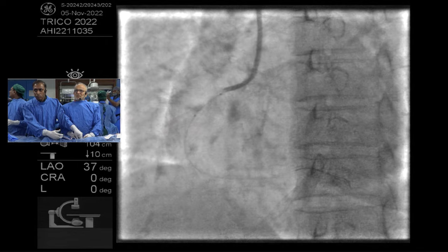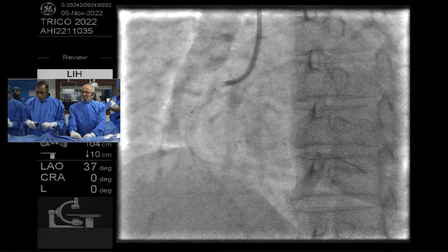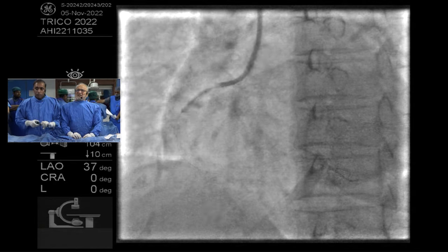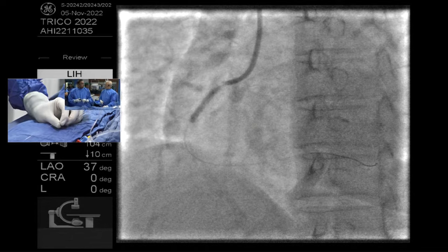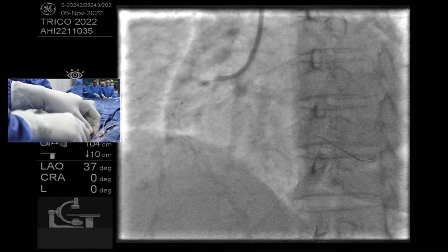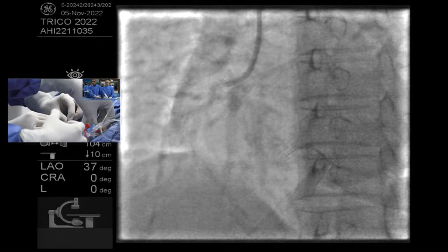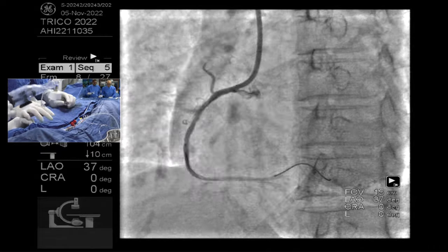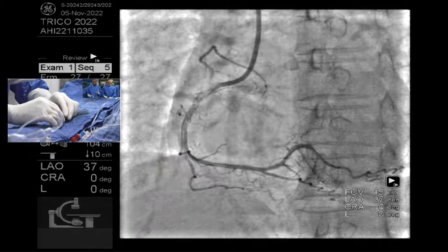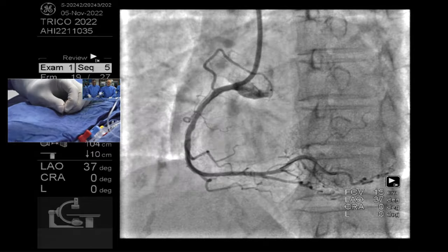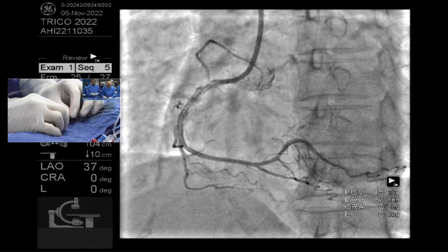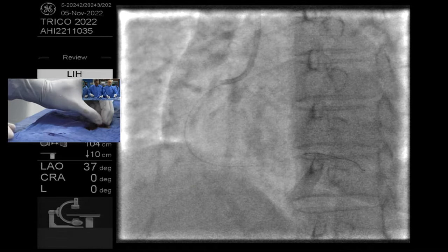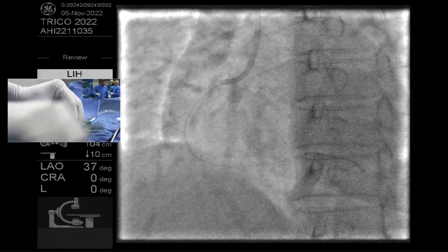Just to confirm — this was a drug-eluting stent in April? By and large, almost 100% are drug-eluting stents in India. Nobody uses bare metal. We should perhaps have taken a 2mm balloon rather than 2.5mm — because if it was under-expanded at initial deployment, that might have been corrected with the 2.5mm and we would get a different picture on OCT. Let's do OCT and we'll evaluate the tissue character scientifically.